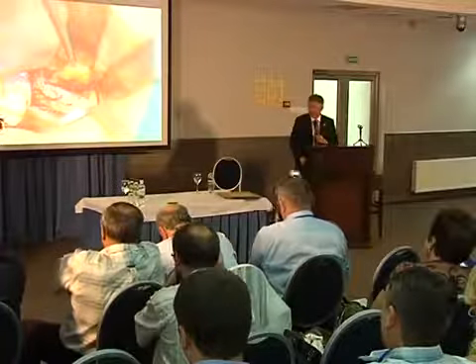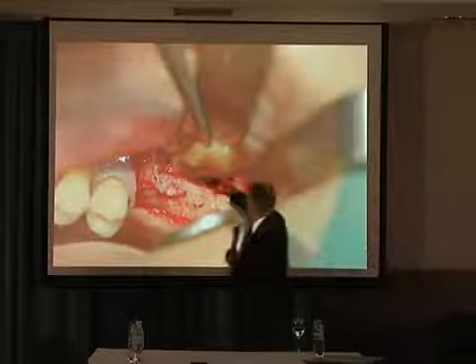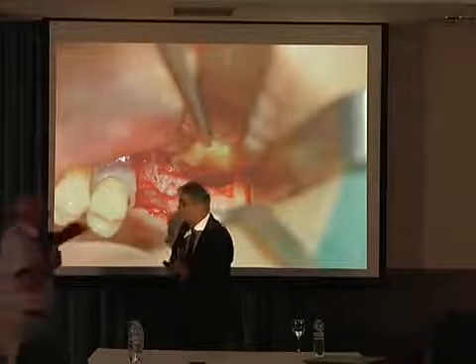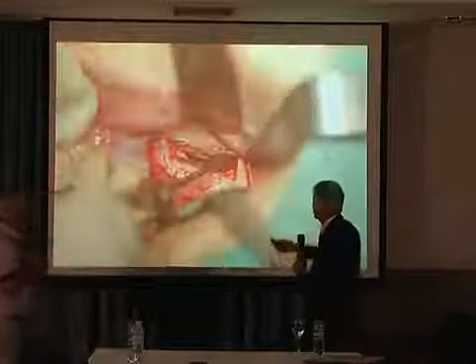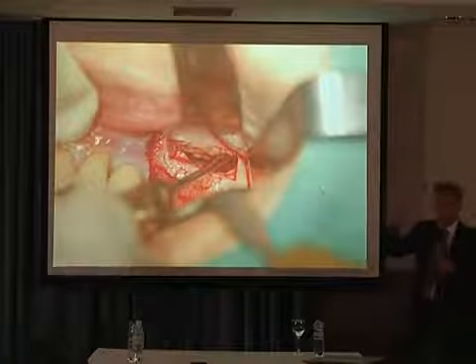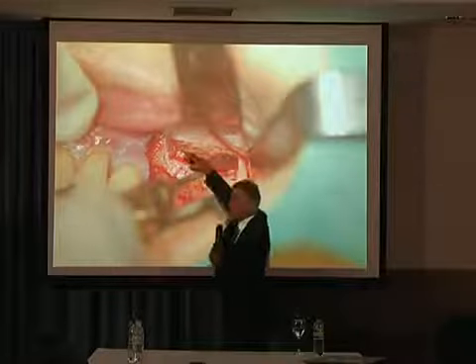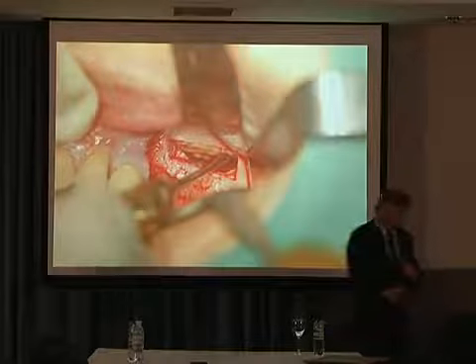What is the mechanism of this? Look. No, I understand. The Schneiderian membrane is up, and this is on the Schneiderian membrane. Okay, fine, but second layer. How does this cloth affect the membrane? Look, the next picture. Я не в этом плане. Here you must take a photo. Положить ее. Зачем? This is important. Yeah, okay, because I think this is beautiful, because it is sticky to the Schneiderian membrane. I got it, your point.